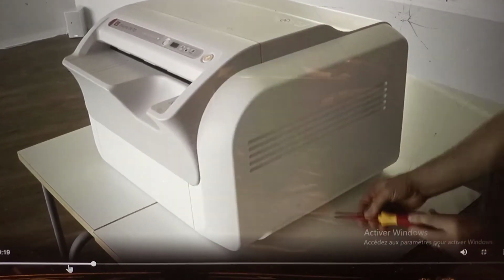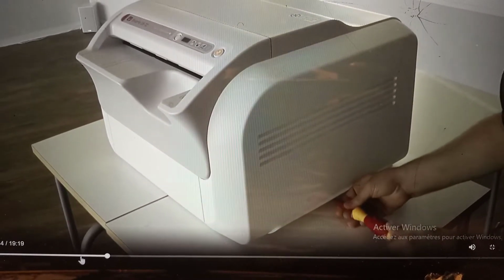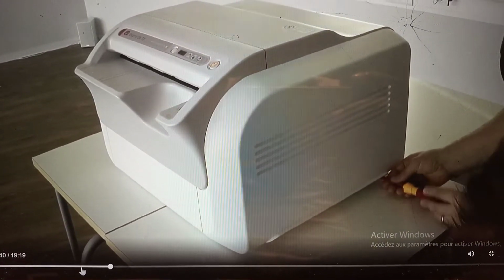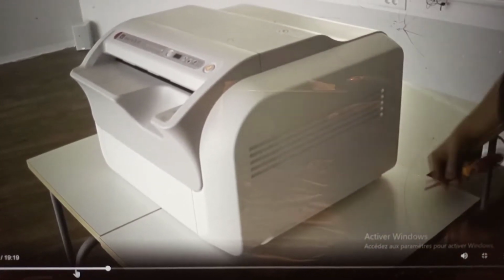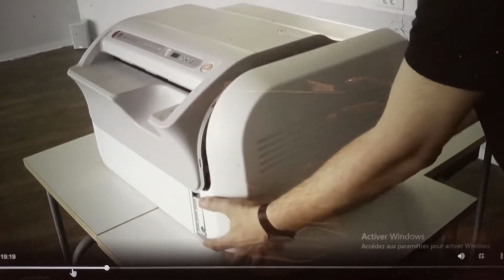On the bottom side, you have 3 screws. And after removing them, you can pull up the side and take it away.